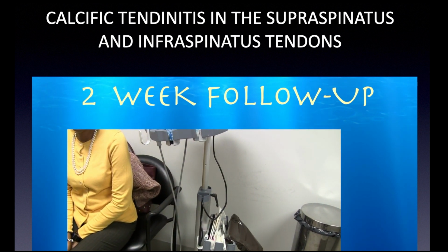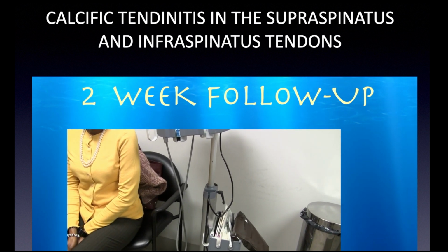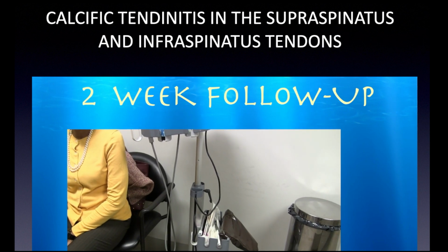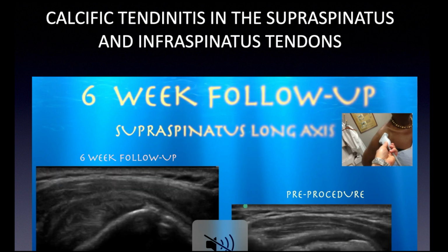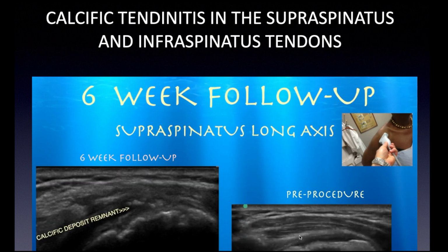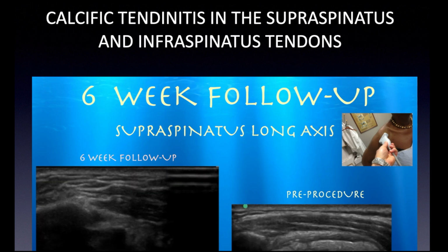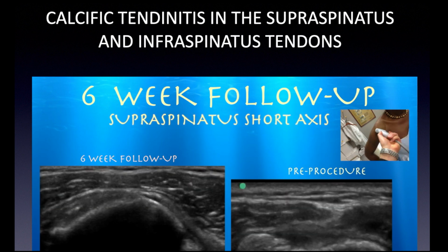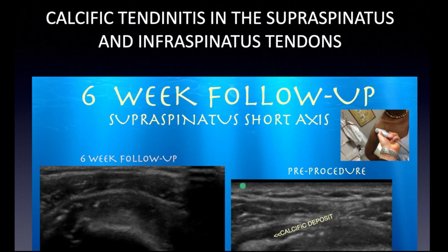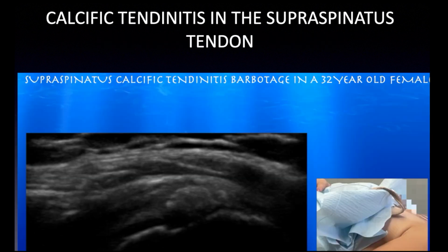Feels a lot better? Okay. How much pain relief did you get? Like 100%, 80%, 10%, 50%? Oh my gosh. No, the pain is almost gone. It's almost gone, okay, so it's pretty good. And here we did a repeat scan. So you see all these little remnants of calcium. Here's initially. So it's one of those very satisfying procedures with ultrasound. This is where you feel like, yes, you're happy to be a doctor and actually help people. People are very satisfied.